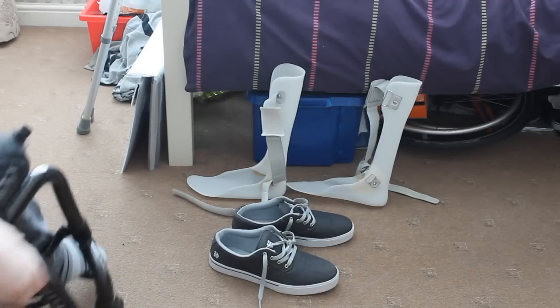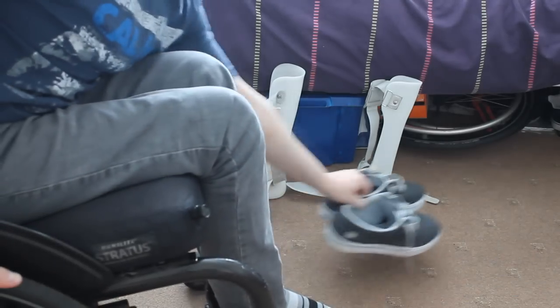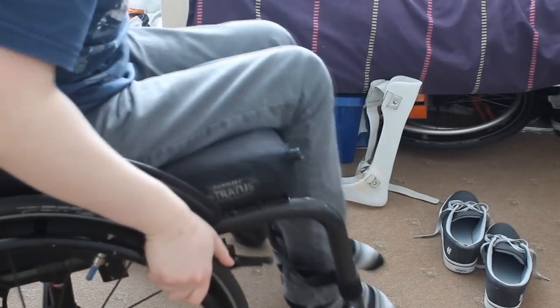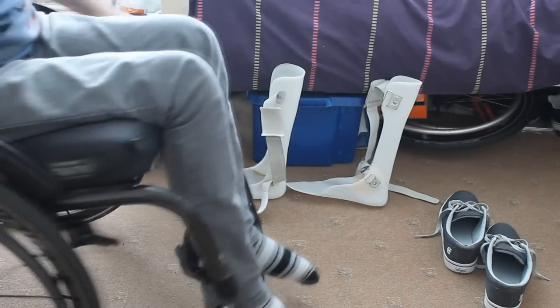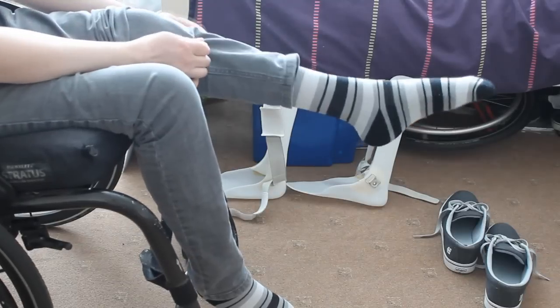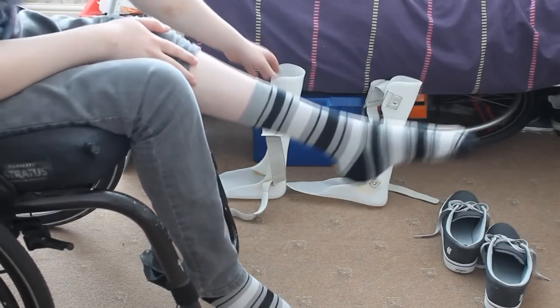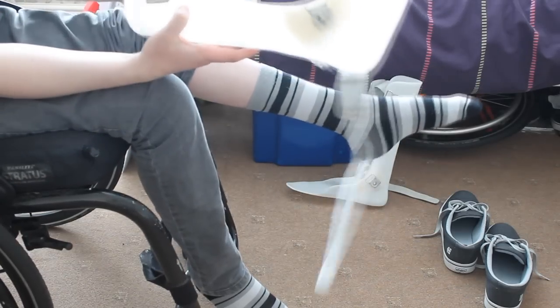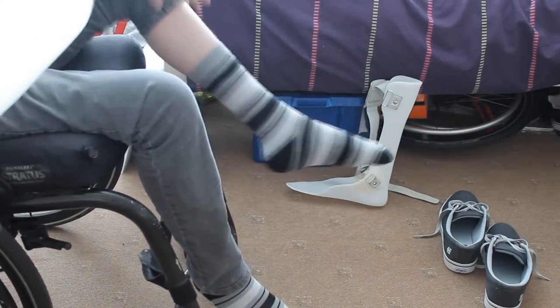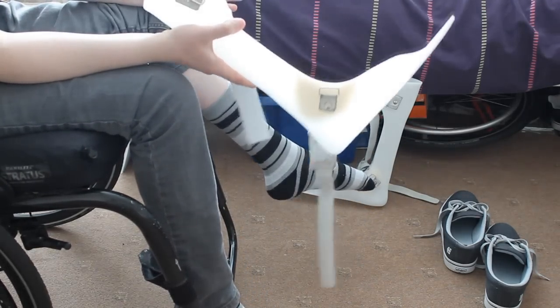Hopefully this angle is good enough to show you me trying to put these splints on. I'm just going to move the shoes out of the way at the moment. What I normally do is bring my jeans up a bit on the leg, and as you can see the foot just kind of goes down like that — I can't control it to go up. So I just put these splints on and that solves all the issues with that.